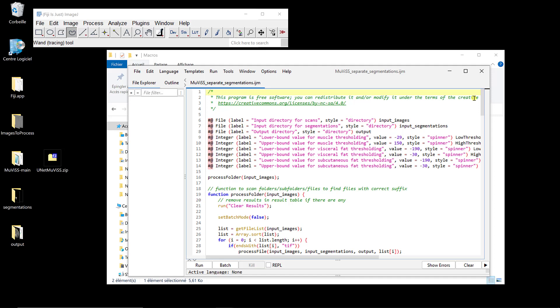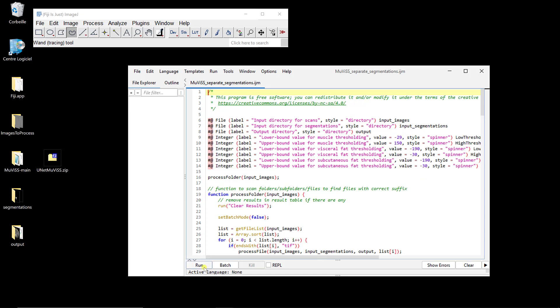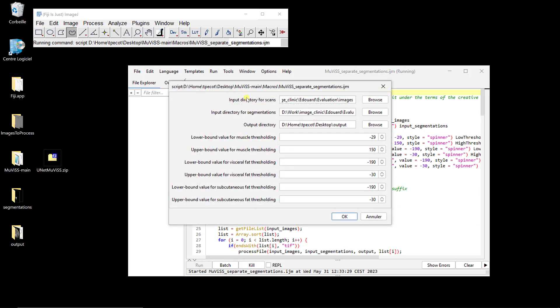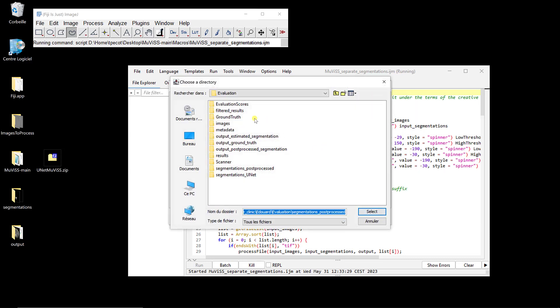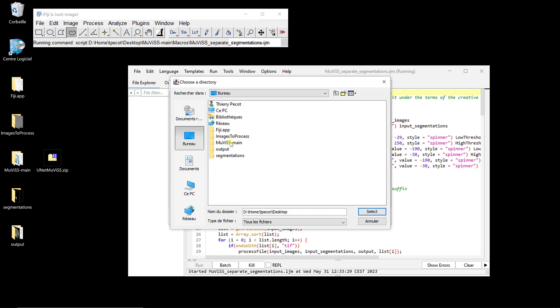And so it looks very similar to the previous one except that now, so if I run it, you have an input directory for scans. So that's the same. Now instead of the input directory for the model here, it's the input directory for segmentation. And so here I'm going to go on the desktop and I'm going to define segmentation for it.